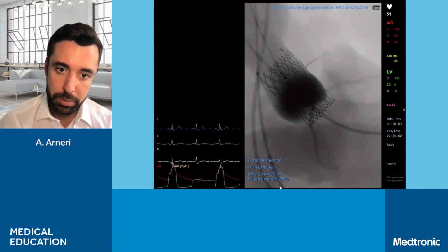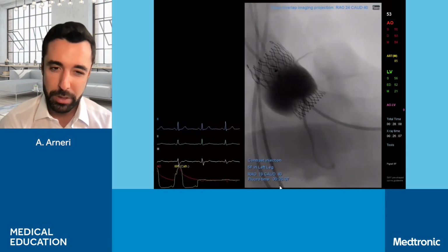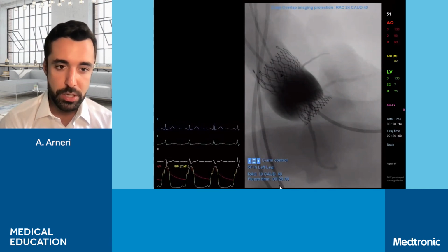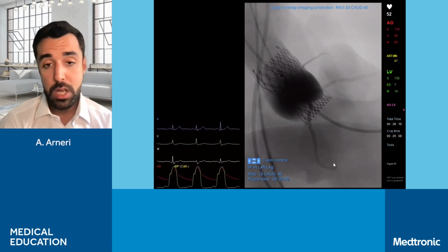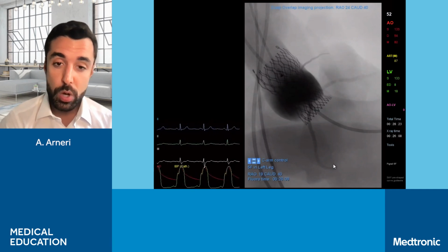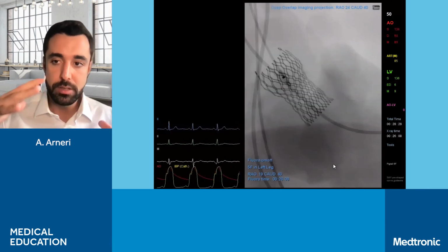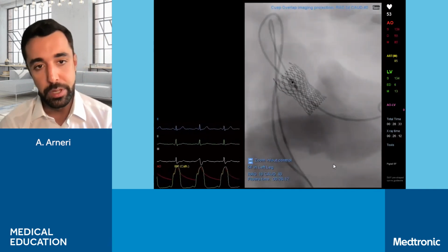And you see that our implant depth is a bit higher than what we wanted to achieve. 3 millimeters is probably 5 now, but still there's no ECG problem here, and we don't have much PVL, so we can accept the result. If you really want to reach a perfect result, you could do a post-dilatation here, but that PVL is really trace and is going to disappear over time because the nitinol is going to keep pushing over the aortic annulus.